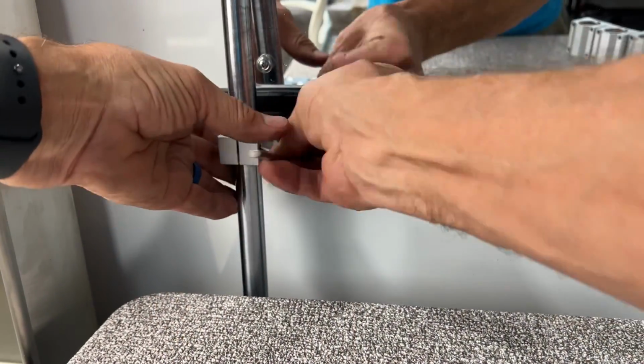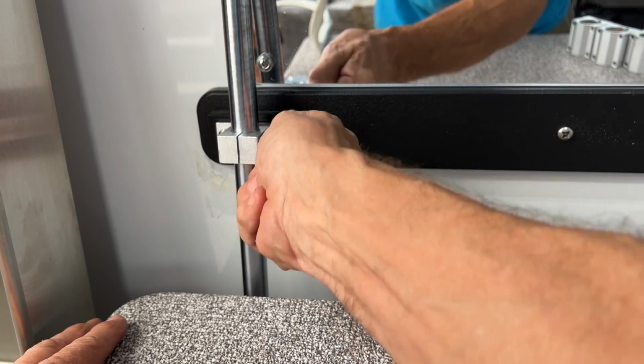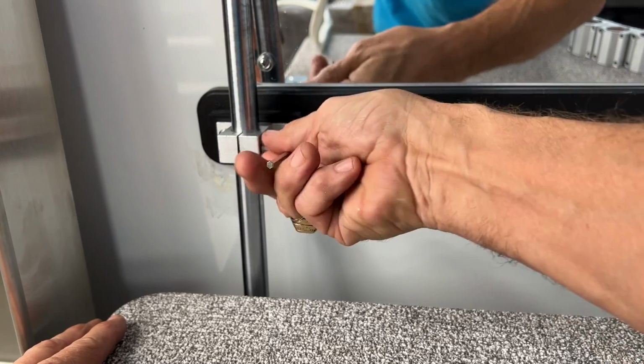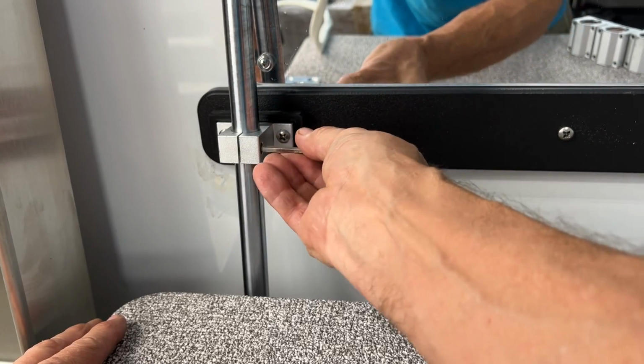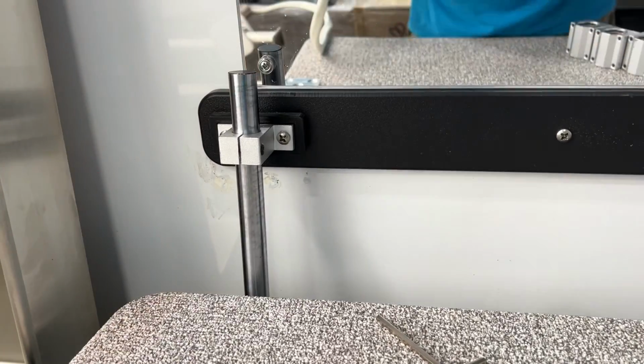Now go to the top of the table and loosen the set screw on the top bracket. We're going to do this so we can lower the rail back down. When you lower the rail back down, we don't want to go all the way. I want you to notice how far I take it down. So go down to about there and stop.